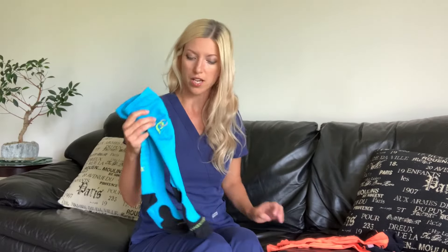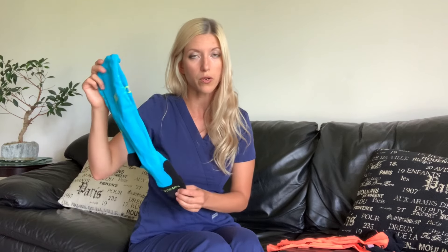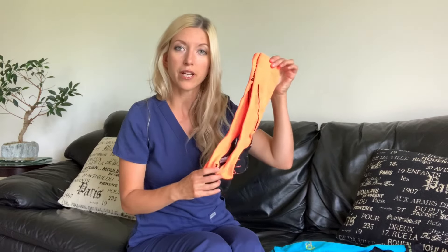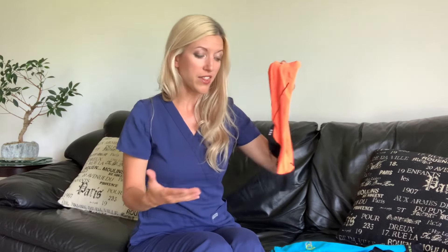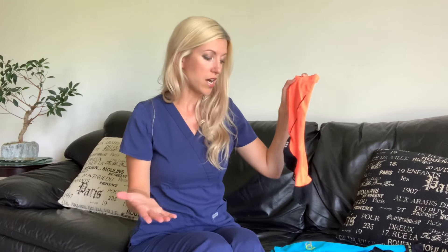There are two brands of compression socks that I currently use. This one is newer to me — it's called Pro Compression, and I just did a review on these socks not too long ago, so I'll put the link down below. The other brand I use is the CEP brand. I've been using this brand for years and I absolutely love these socks. I'm going to demonstrate today how to put on compression socks and I'll show both, so you can see how much effort is needed for each brand.